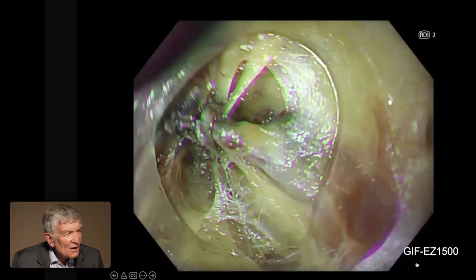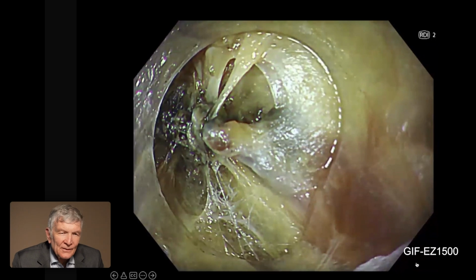Yeah, that's always critical at the cardia in POEM, and then you also increase the risk of secondary ischemia to the overlying mucosa if you have to coagulate too much blindly. So anything which helps us for better targeting is likely to improve the outcome, but we don't know.